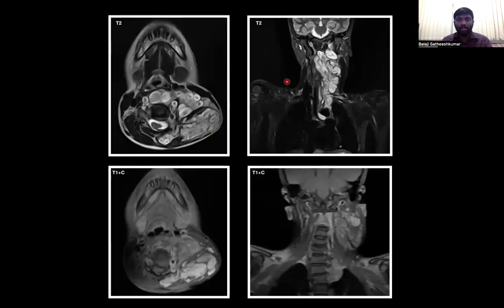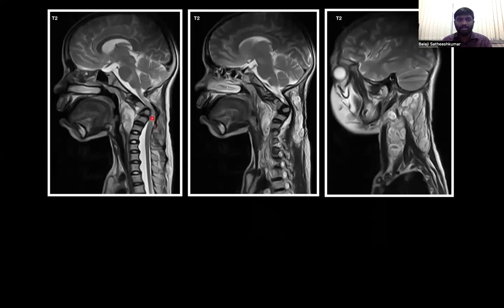Moving on, we see multiple variable-sized T2 hyperintense lesions extending from the skull base up to the anterior mediastinum involving the entire left side of the neck, which show T2 hyperintensity with central hypointense areas suggestive of plexiform neurofibromatosis. These show mild to moderate enhancement on post-contrast study. The same patient on sagittal image showed a severe kyphotic deformity at the level of C2, C3, C4 and acute angulation at the level of C3 causing spinal canal compression and spinal canal stenosis.